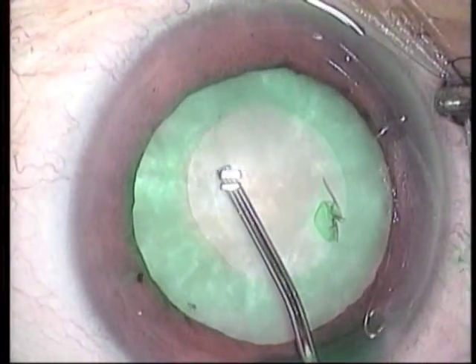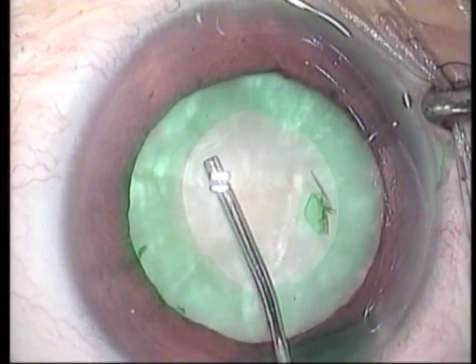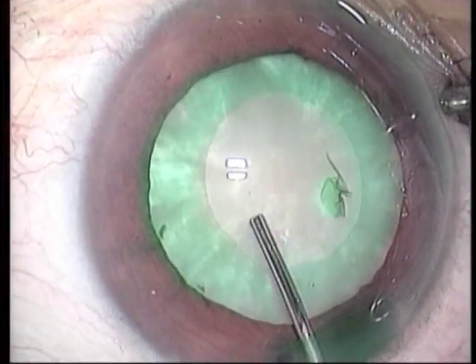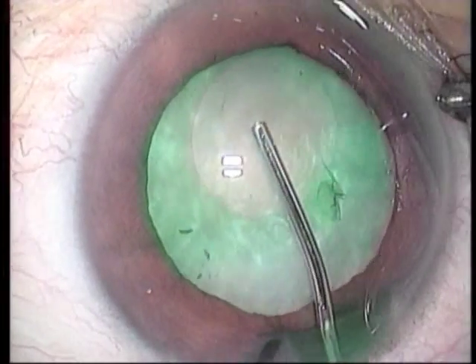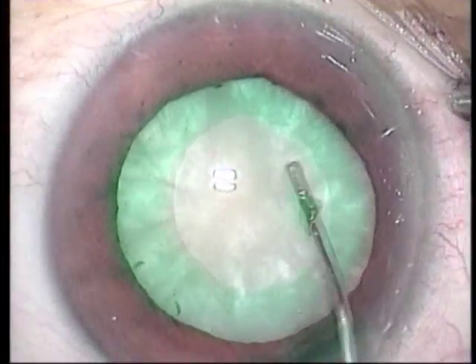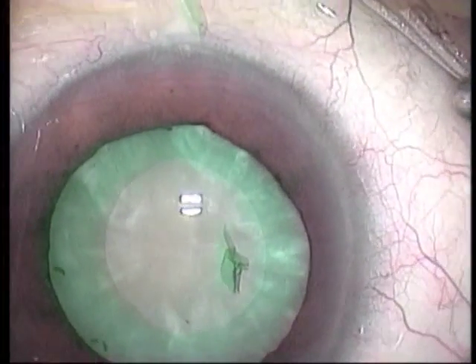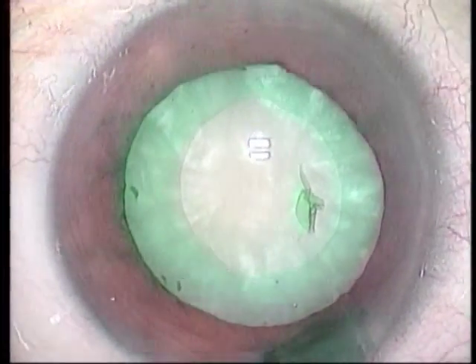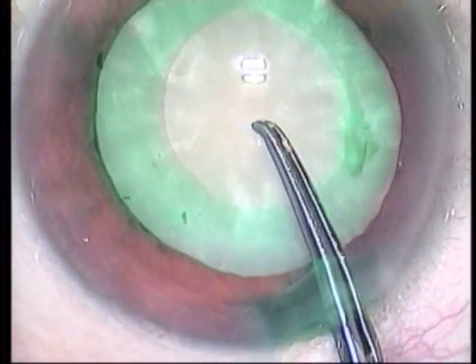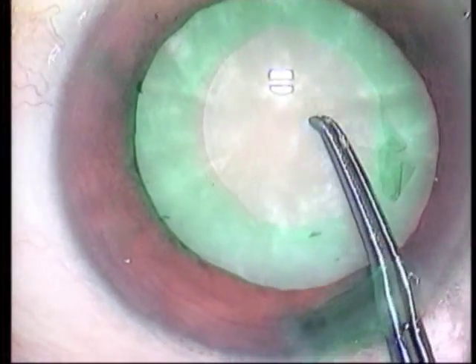A 27-gauge blunt needle is inserted to perform hydrodissection, but it isn't able to penetrate the white cortex. It seems that there is yet another anterior capsule. It fluctuates when pressed with the tip of the needle and the membrane seems to reflect.